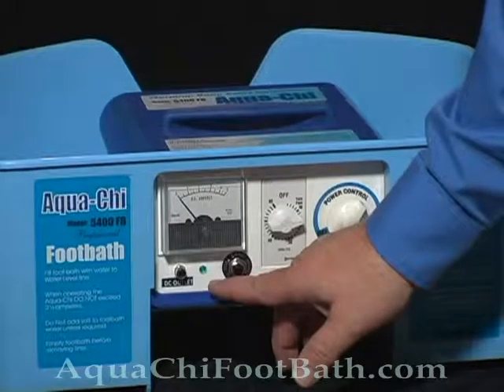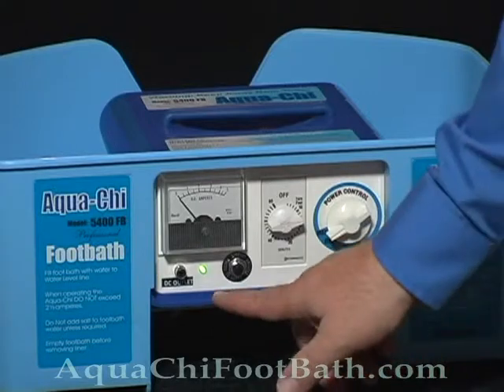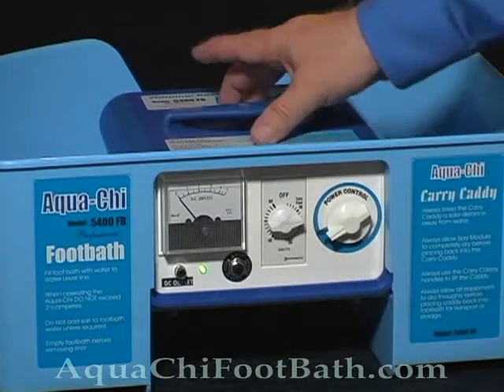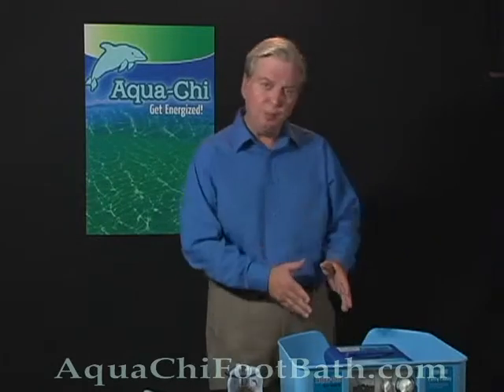All right, as you can see, the light has gone out. So let's turn the power control back to max. And the light has come back on. Now, if this light does not come back on, then there's a problem with the power pack, and you should call technical support immediately. All right, now we know the problem is not with the power pack.